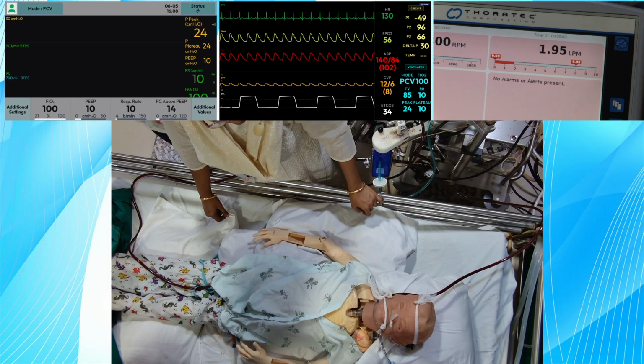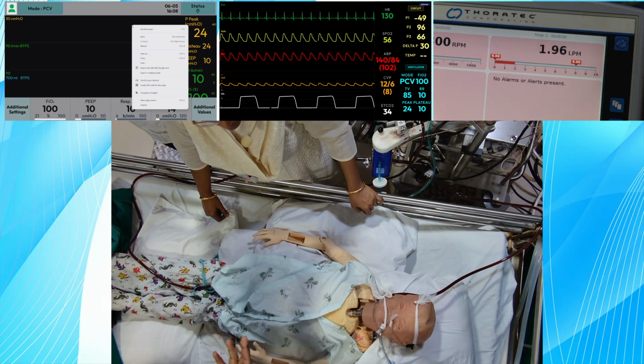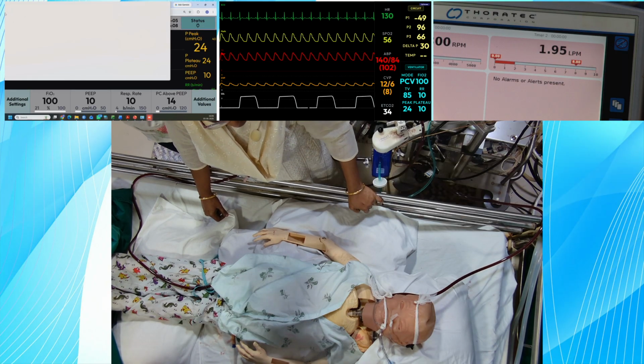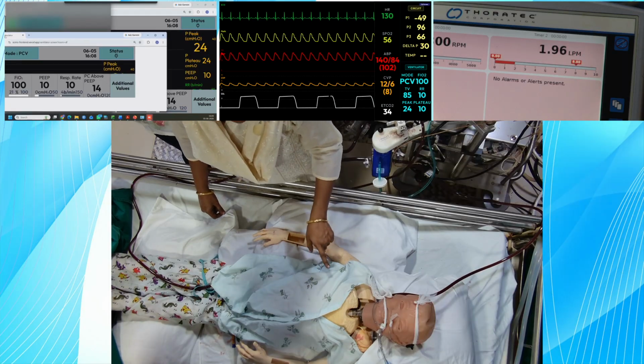Recirculation. So you are blended now, we switch to oxygen, na? Yes, oxygen cylinder, isn't it? That has been changed, but no difference. If it is still the same, can we increase the flow? Bilateral air entry, sir, has decreased. You do whatever you want.